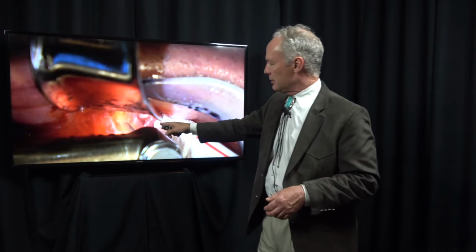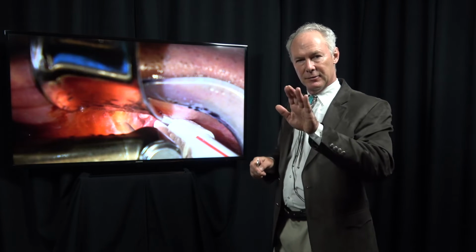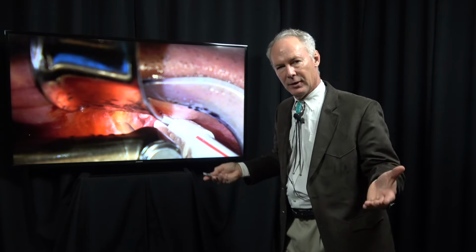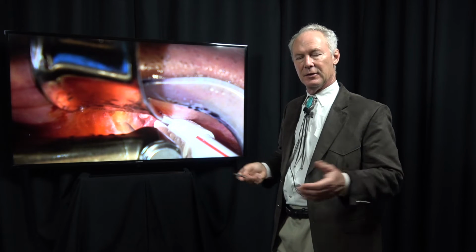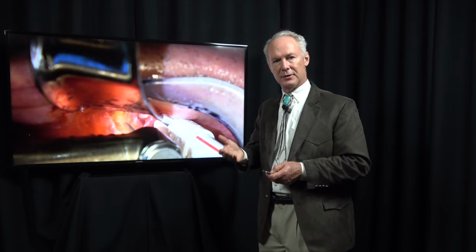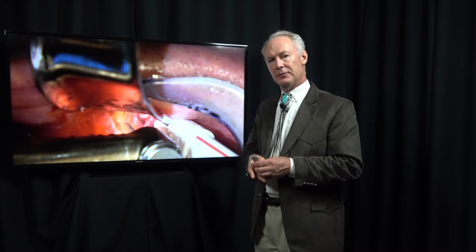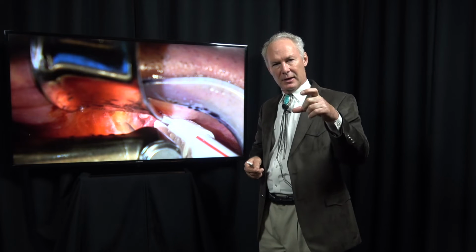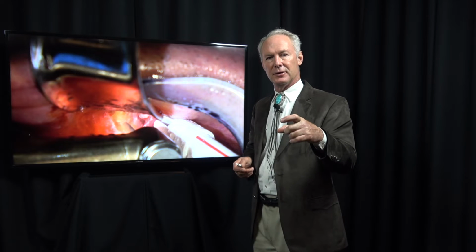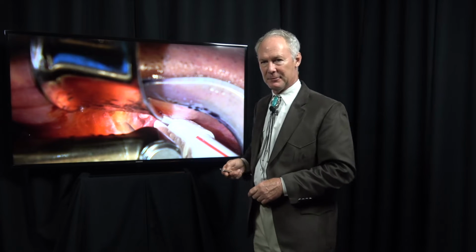It's very important when you get through with the apicoectomy that you've got enough root left that the tooth is stable and not mobile. You could always splint it to the adjacent teeth if you needed to, but that might be an indication to go ahead and extract the tooth and place an implant if you did not have enough remaining root structure to stabilize that tooth following apicoectomy.